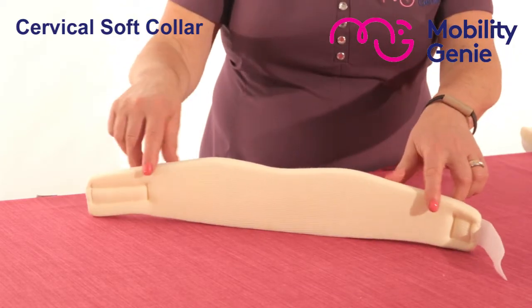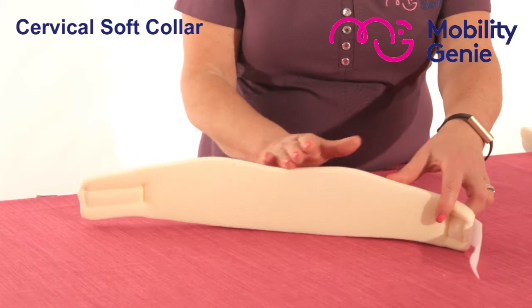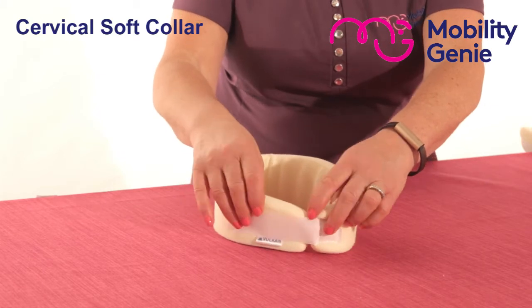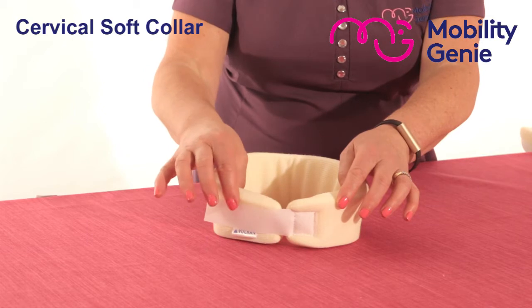To close the collar you simply wrap it around the neck with the curved side under the chin, and you put one side over the other using the velcro strap. If there's a little gap that's okay.